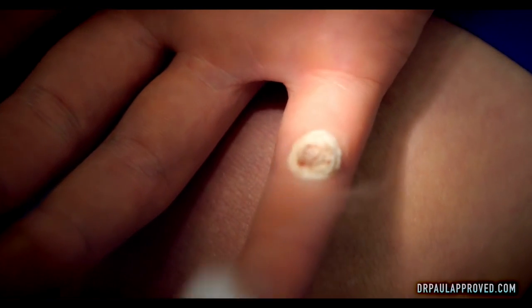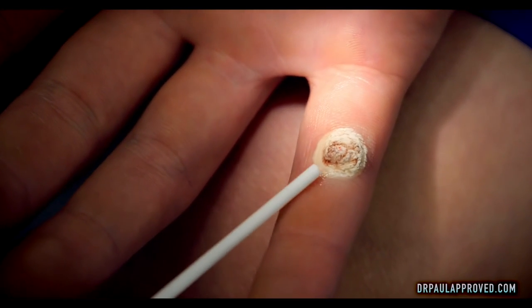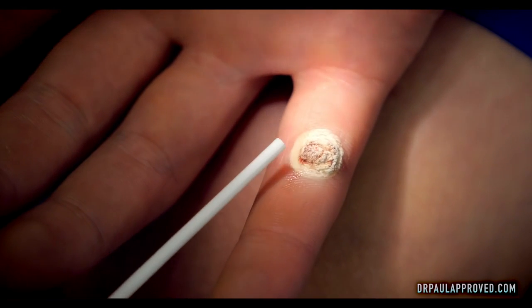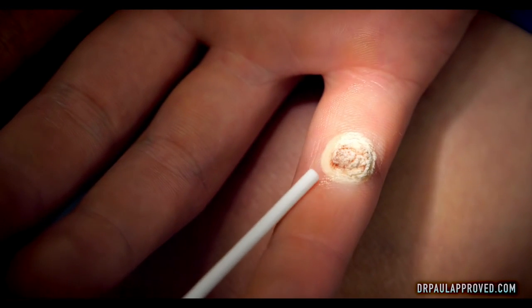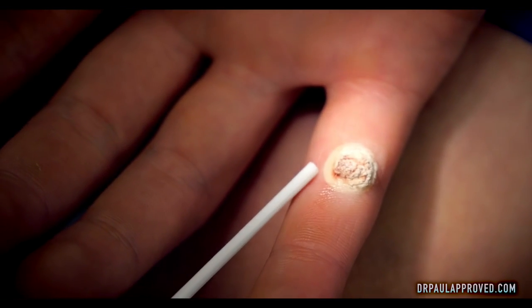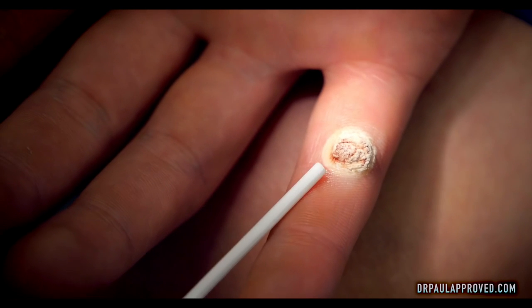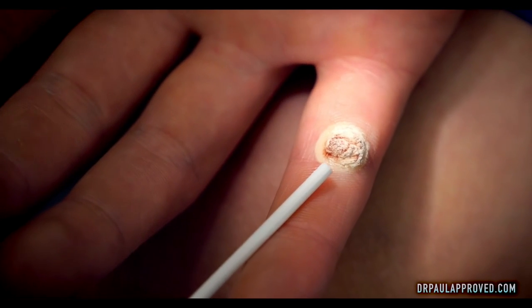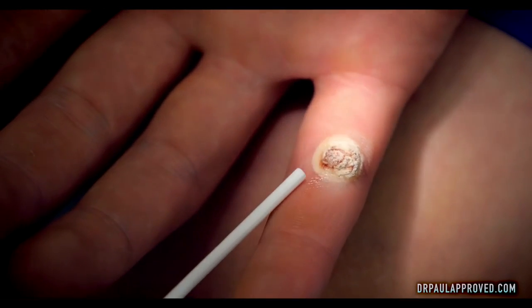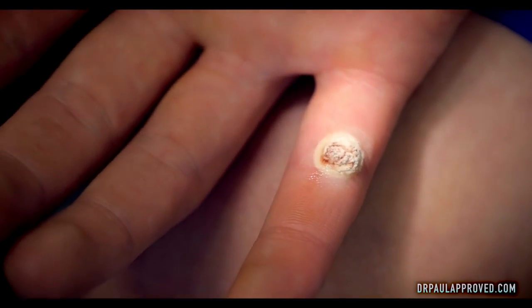Occasionally when you do a deep freeze like this, the area of frozen normal tissue could actually get a blood blister. Don't panic if that happens — that's almost a good thing. Warts almost always fall off if you get a blood blister. The area that's frozen white here will turn pink after it thaws, and hopefully within the next month that'll just drop off.